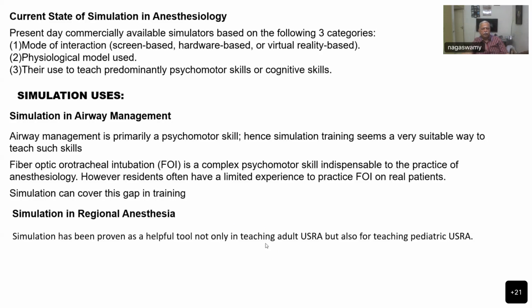Then simulation in regional anesthesia has proved helpful for ultrasound guided regional anesthesia blocks and also for pediatric ultrasound regional anesthesia. Both adult and pediatric, you can get trained with that.